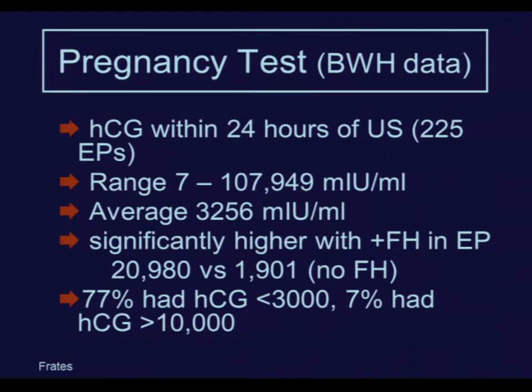This is a report of some data from Brigham and Women's Hospital where we looked at the HCG that was measured within 24 hours of an ultrasound in 225 patients with proven ectopic pregnancy.